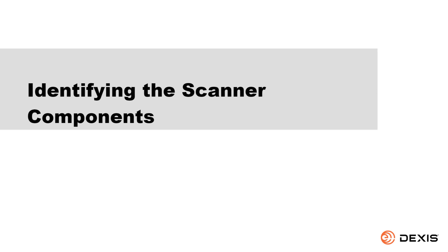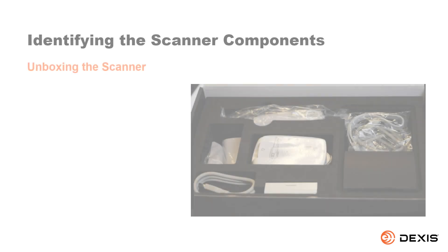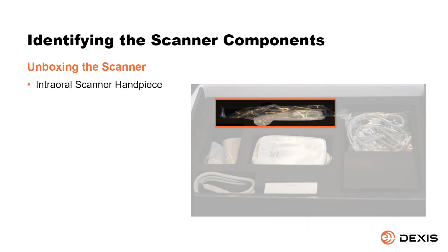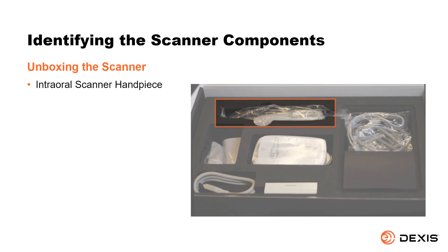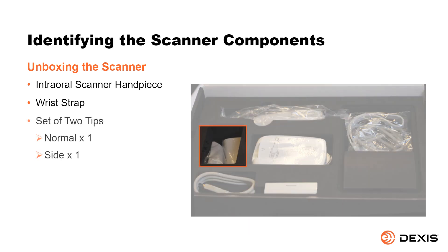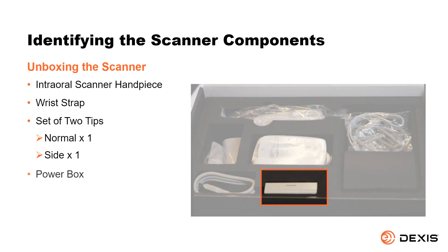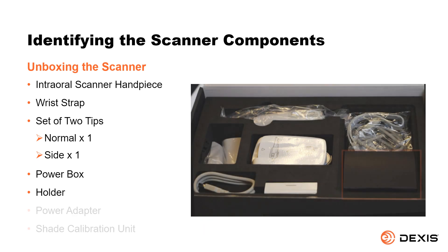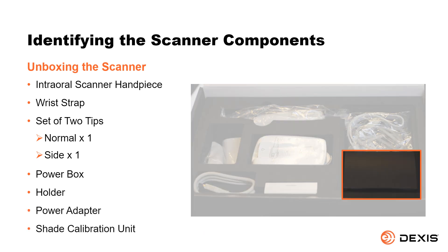Identifying the scanner components. The DEXUS IS 3700 is delivered with the following components: the DEXUS intraoral scanner handpiece, a wrist strap, a set of two tips — one normal and one side — the power box, the holder, the power adapter, and a shade calibration unit.